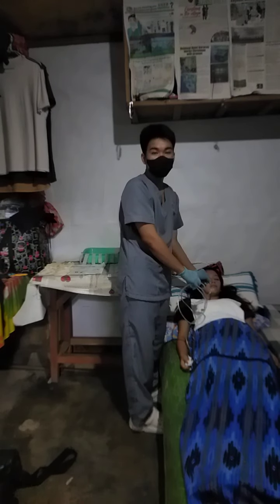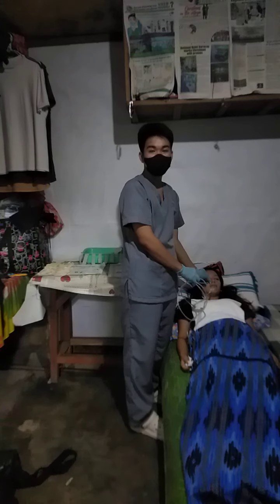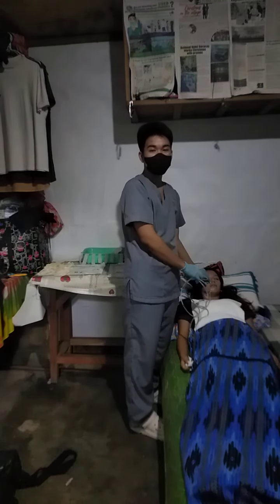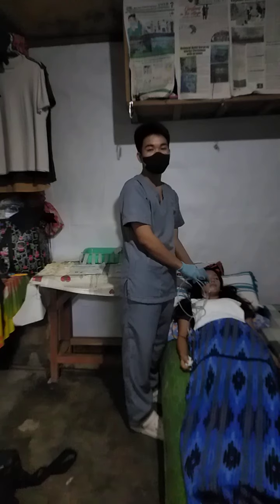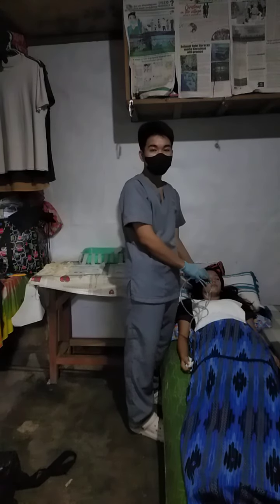Next, if gagging and coughing persist, stop advancing the tube and check placement of the tube with a tongue blade and flashlight. If the tube is curled, straighten it and attempt to advance it again. Excessive coughing and gagging may occur if the tube has curled in the back of the throat.